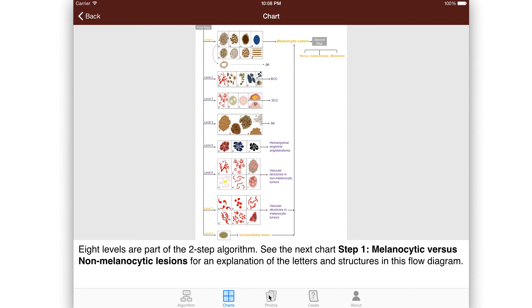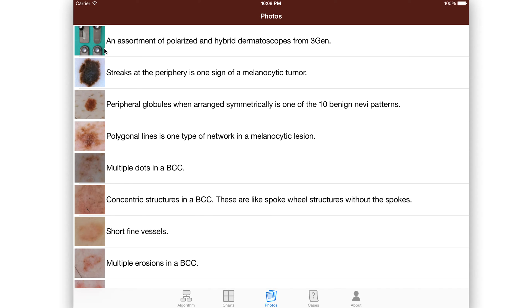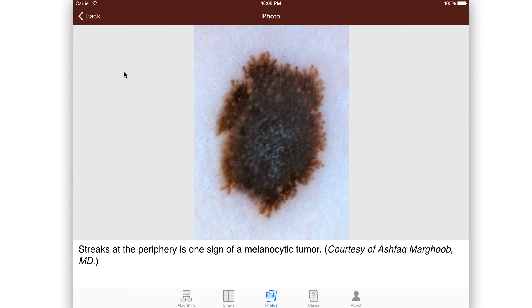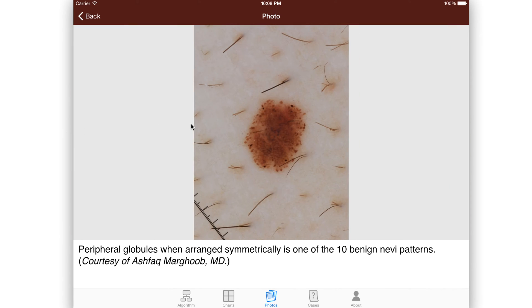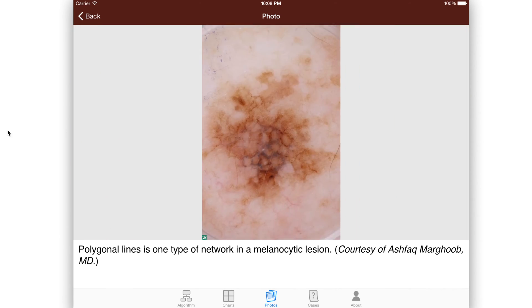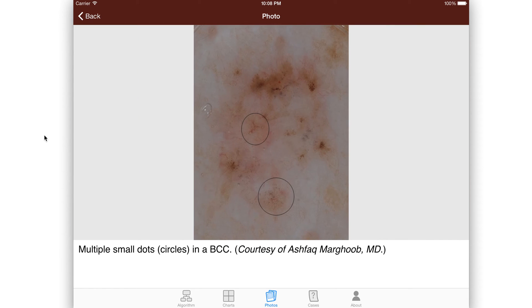All the photos that are used in the examples are visible just as photos. So if you want to see examples of streaks, peripheral globules, polygonal lines — here we have multiple small dots within a basal cell carcinoma — so lots of examples of dermoscopy.